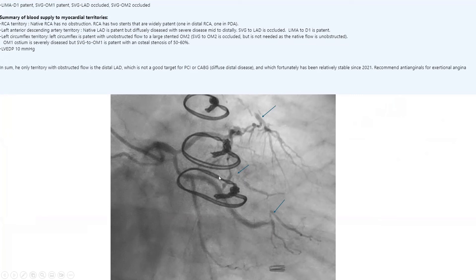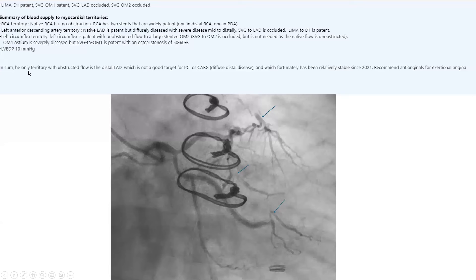In the case shown earlier, we reported it by territory. For the circumflex territory: the left circumflex is patent with unobstructed flow to a large OM2, the graft to OM2 is occluded but not needed because the native vessel is unobstructed, and there is a patent graft to OM1 — so overall unobstructed flow to the circumflex system. In sum, the only territory with obstructed flow is the distal LAD, which is not a good target for PCI or CABG.